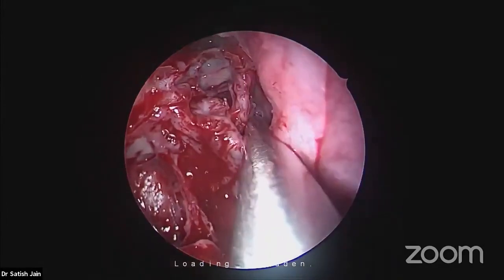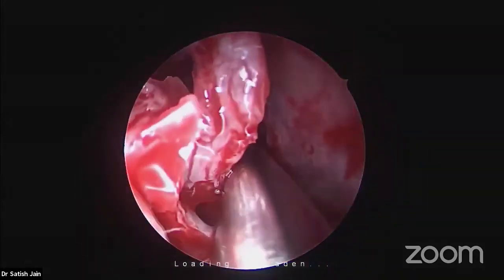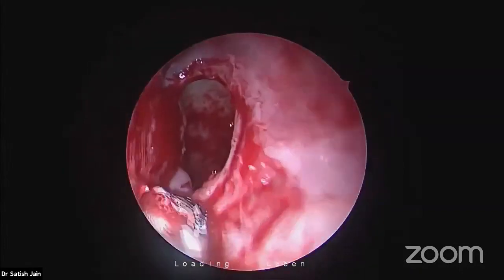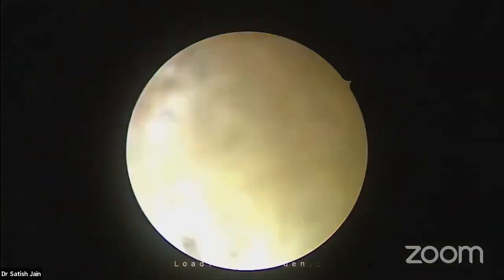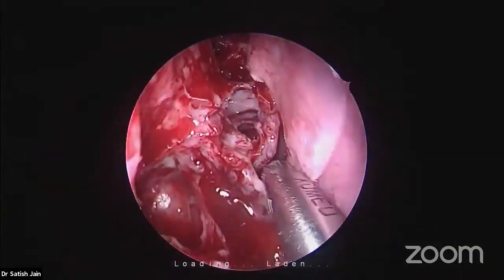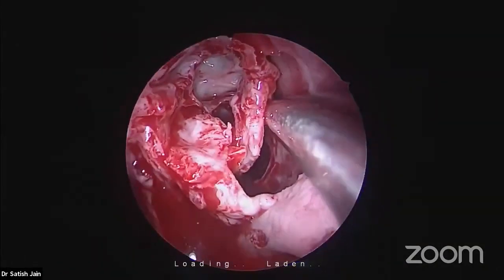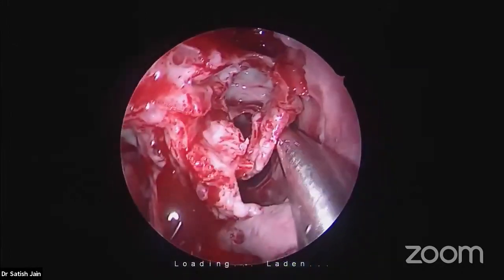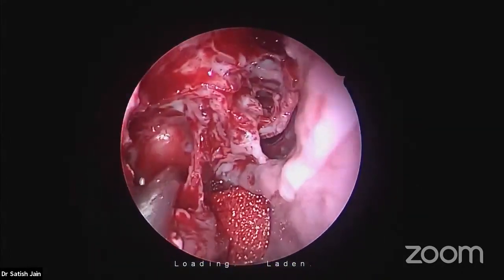It is two to three millimeters away from the septum. Is this a case of Onodi condition? Suppose now I have widened it, and suppose that is the roof of the sphenoid there. If I don't take this into consideration and I go there to open, it would be a disaster. You would get a CSF leak. That's why this maxillary line is so important.